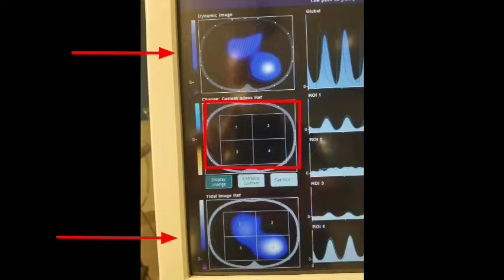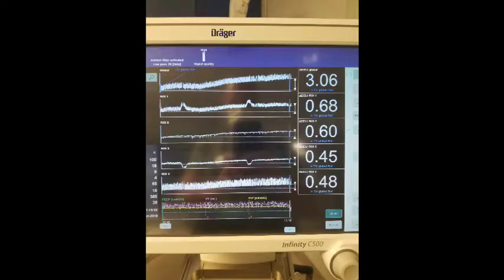So this is the important thing that you must know when using PulmoVista. I suggest that it is not to be used while you're actively removing fluid. As you remove the fluid, the impedance will increase. There's less fluid, the signal's getting across less. The tomography is interpreting that as there is less edema, there's less fluid. So basically it's giving a false impression that you are recruiting.